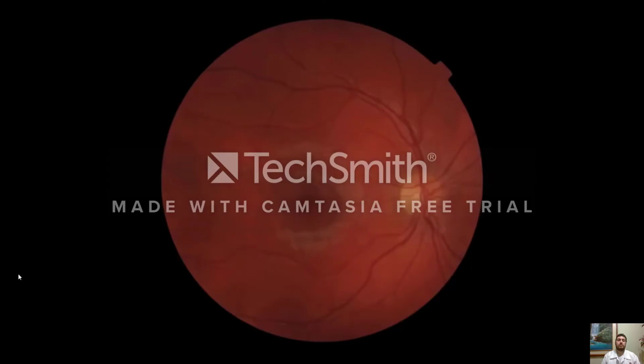The eye, in fact, is the only place in the body where the veins and arteries can be directly observed without making an incision. This retinal photograph is of a healthy eye, but it will still be saved in the patient's record, so that when the patient returns for their eye examination in 1 or 2 years' time, another retinal photograph will be taken and the photographs can be compared, and any changes which are taking place will be spotted immediately.